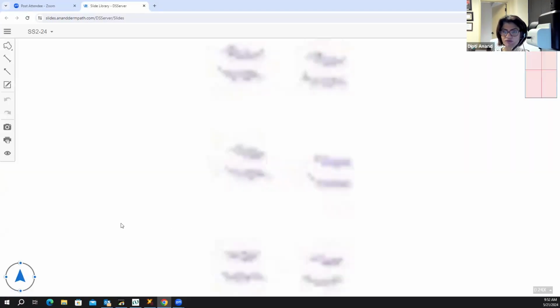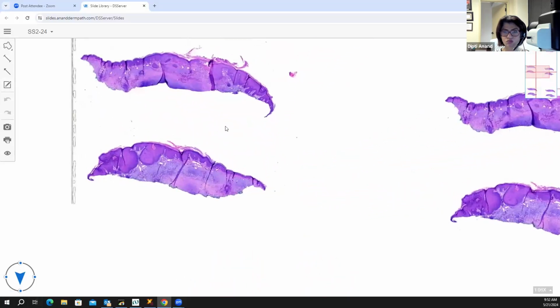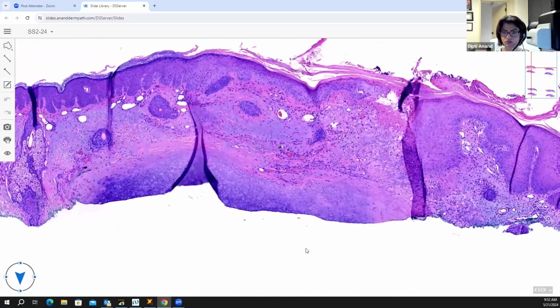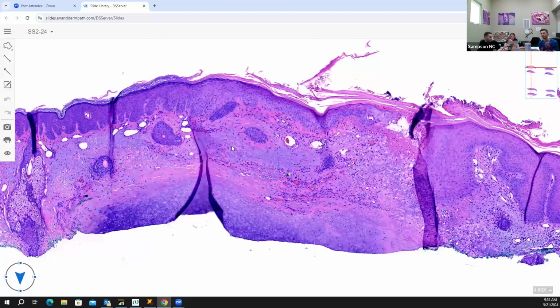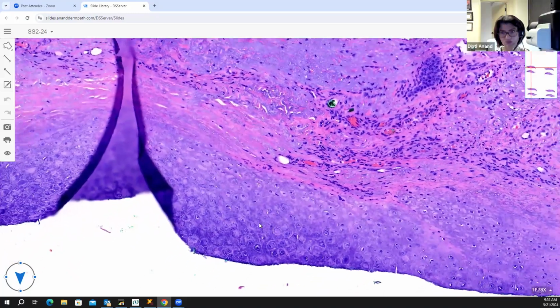Okay, 24. I might need a little help on this one. It looks like part of the epi has some PEH change going on there, and then there are these enlarged vessels. And then there were some spots where I thought I saw sebaceous glands. It looks like we're on the face here. And then at the bottom there, is that cartilage maybe? Like plain cartilage?